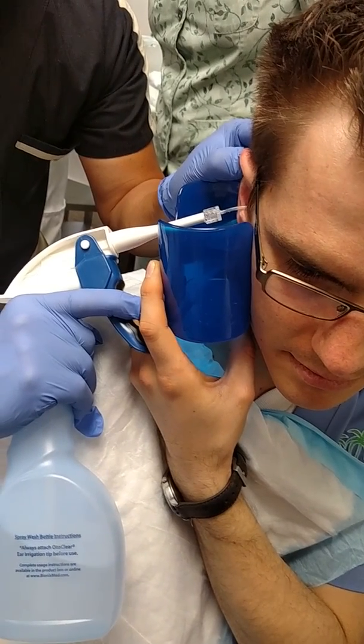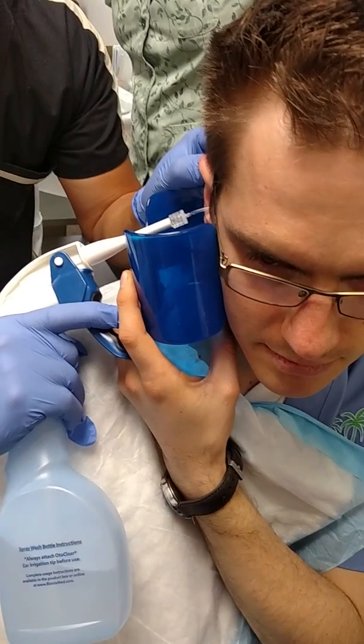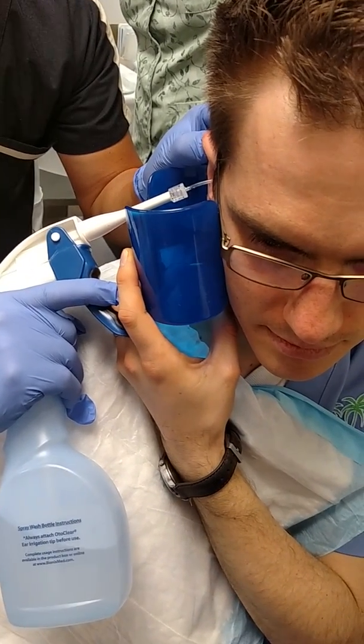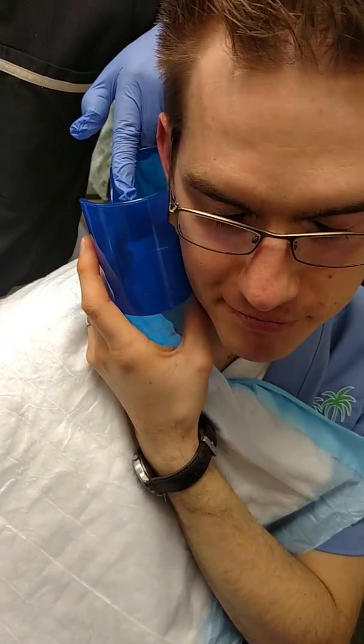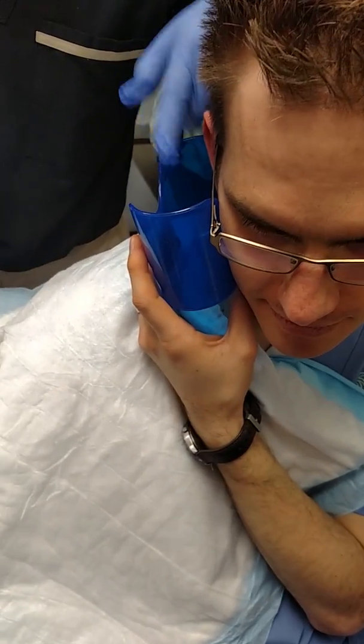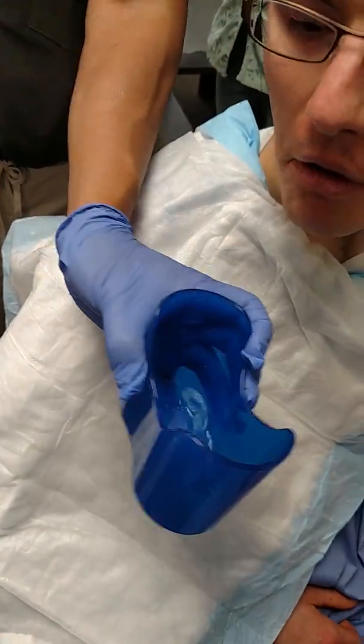Are you guys with me? Not too strong that you could bust the eardrum. Now you watch for any drained water. Then normally you will see the foreign body or the earwax, and you will see it. Once you see it, you say, okay, now we have a lot that was dislodged.